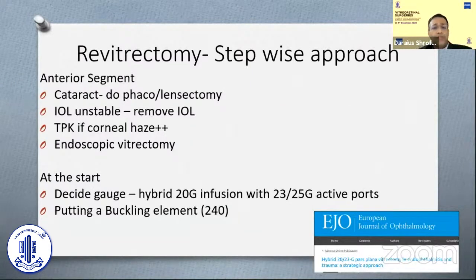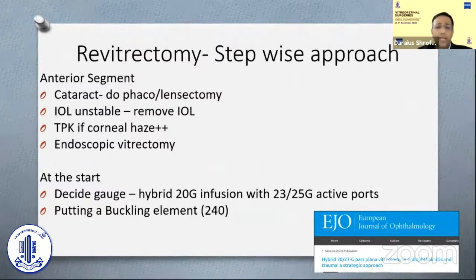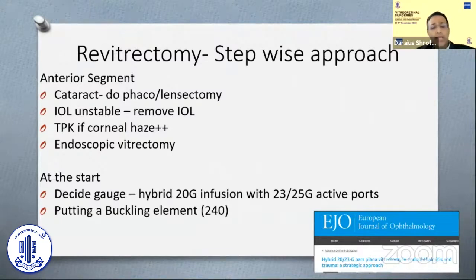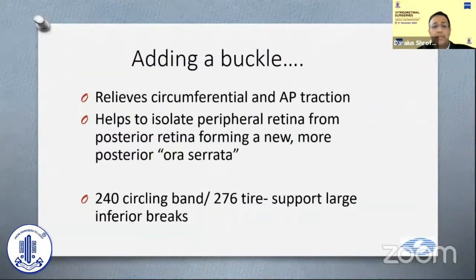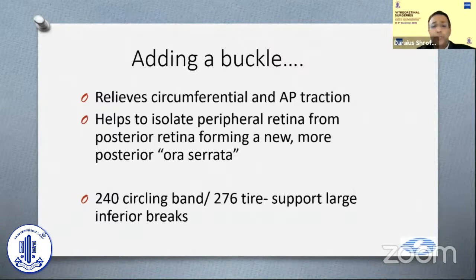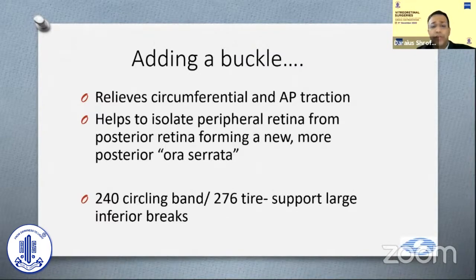When vitrectomy is done again, it must be done in a stepwise manner. For the anterior segment, if there's a cataract, please do a phaco or lensectomy. If the IOL is unstable, remove the lens. At the start, decide the gauge, and putting a buckling element is quite important in most of these cases. Buckling relieves the circumferential and AP traction, isolates the peripheral retina from posterior forming a new ora serrata. We normally use a 240 buckle or 276 tire for large inferior breaks.